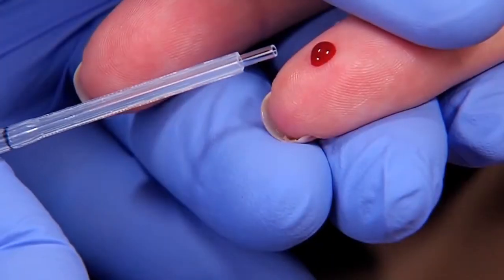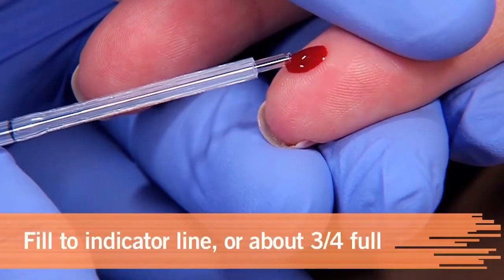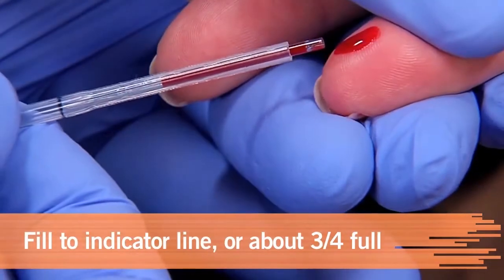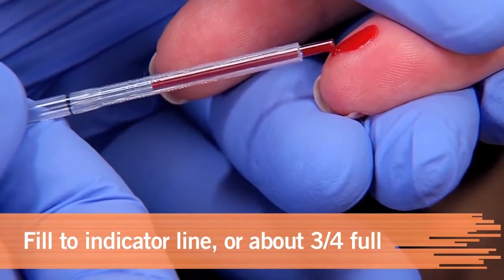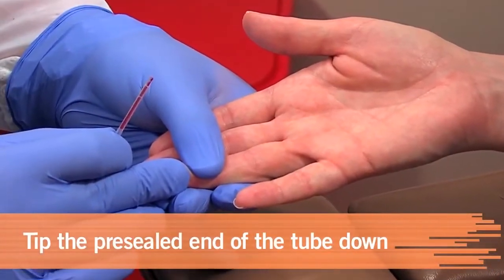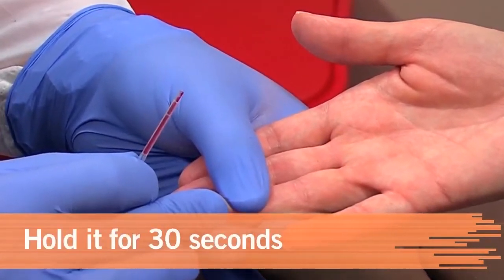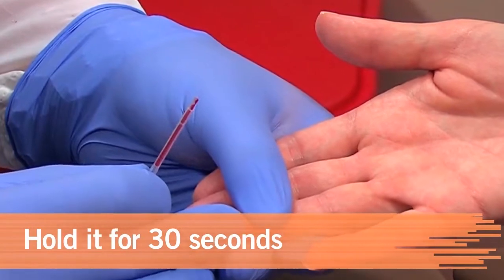Express a large drop of blood and touch the end of the tube to it, not to the finger. Fill the capillary tube about three quarters full or to the indicator line if it has one. Pre-sealed end down, tip the tube. When the blood flows down and touches the sealant, hold the tube for 30 seconds to allow it to seal automatically.